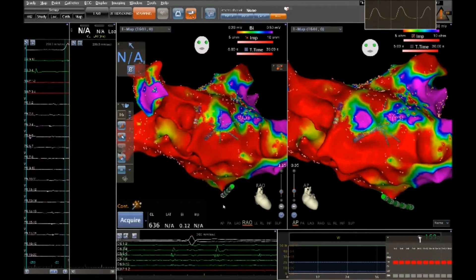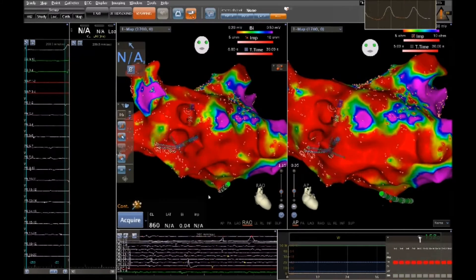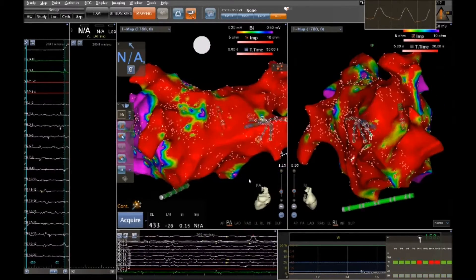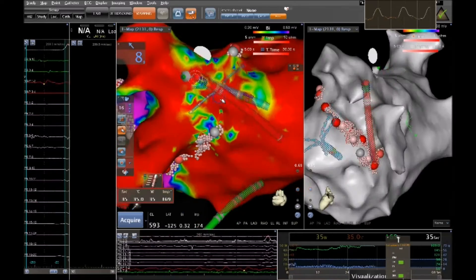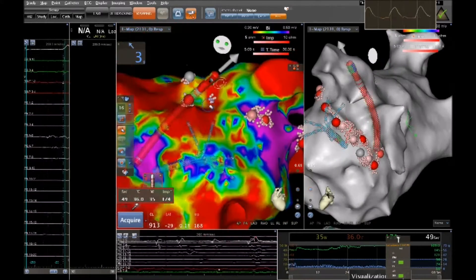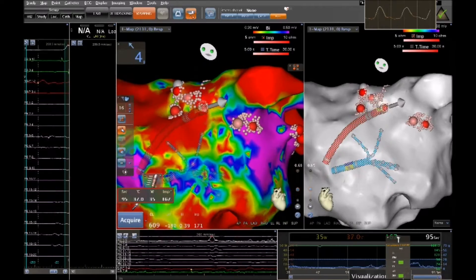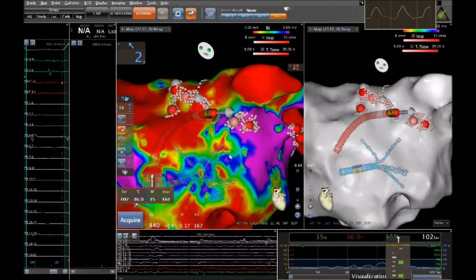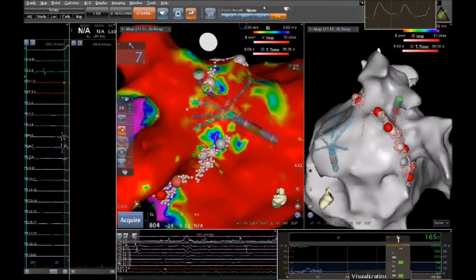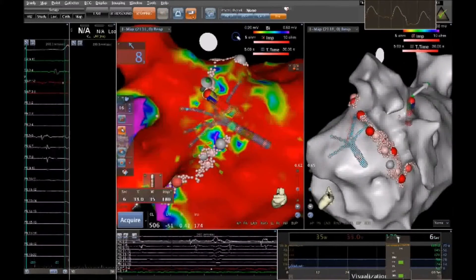Once complete, the electrophysiologist will insert an ablation catheter to target the abnormal electrical signals. This shows a radiofrequency catheter being used to ablate the abnormal areas point by point. The dots show where heat energy has been delivered to destroy specific areas of heart tissue.